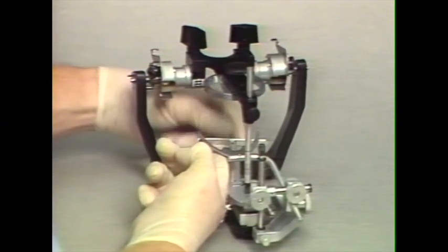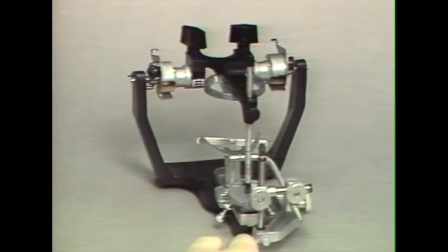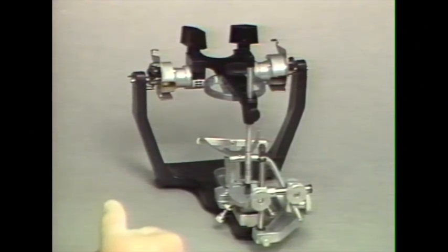Cast support is an integral part of this assembly, and then we can plaster the maxillary cast onto the articulator with this indirect method, which is the method that I normally prefer to use. It's simpler and allows your Facebow to be used for another patient.